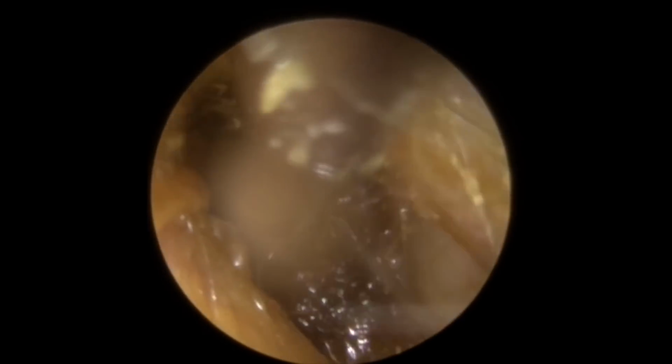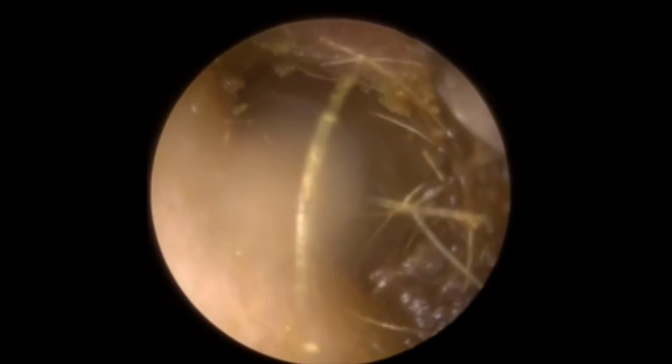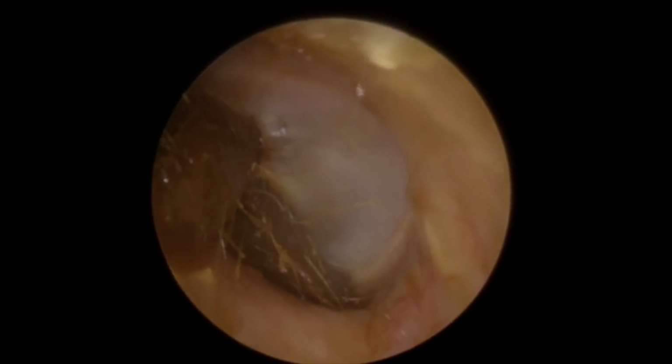A little tiny blob of olive oil on the camera lens there, which we'll get rid of in a second. Let's try and get rid of this piece. So try to pull the top section down. There we go. You see little tiny hairs embedded in here. That's just from haircuts. One deep section now pushed against the eardrum.